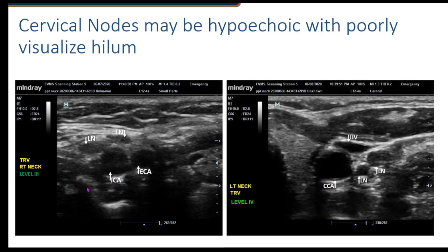At level four — this is level three right here, below the hyoid bone and probably above the cricoid. Once I begin to see a good portion of the thyroid gland more towards the midsection and inferiorly, then I'm at level four. Here's our CCA and our IJV. They're going to run along the IJV. We have a small lymph node here, kind of hypoechoic — you may just see these little hypoechoic beans. This one is a little bit larger and you have a hint of the hilum. That's what I mean by a poorly visualized fatty hilum, but your eye will begin to pick up on them.